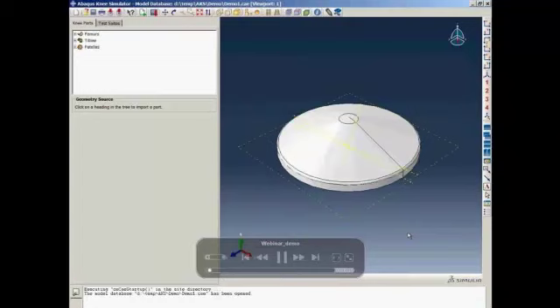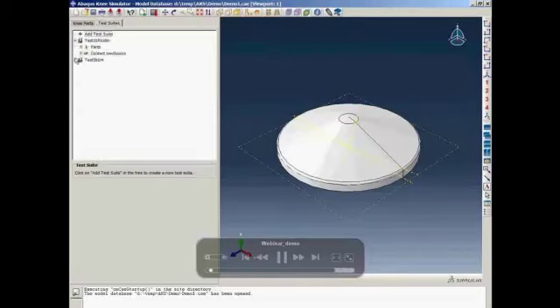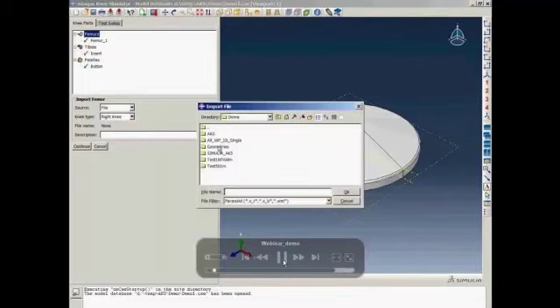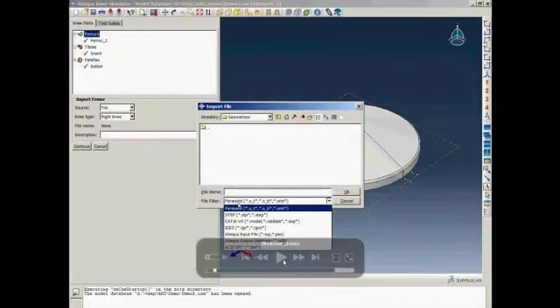So once the database is opened, the user can look at the interface of the Abaqus Knee Simulator. So go through the Knee Parts tab and the Test Suite tab, which is a repository of either implant components or test suites. To import a femur component, I just click on the femurs. There are different sources supported by Abaqus Knee Simulator that include the neutral file, CAE model, or CAD interfaces. In this case, we chose the neutral file. And the user can choose either a left or right knee component. So all the anatomies built into Abaqus Knee Simulator belong to a right knee. So in the case of a left knee being imported, the implant component will just be mirrored to represent a right knee component. A number of neutral files are supported.